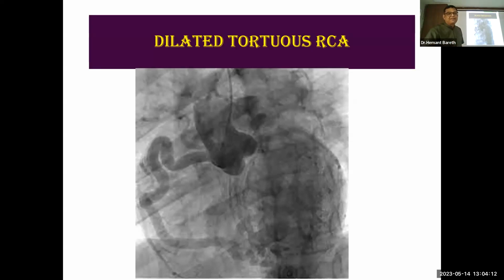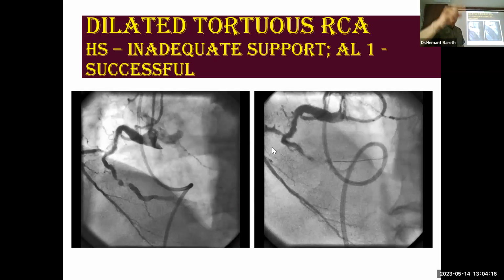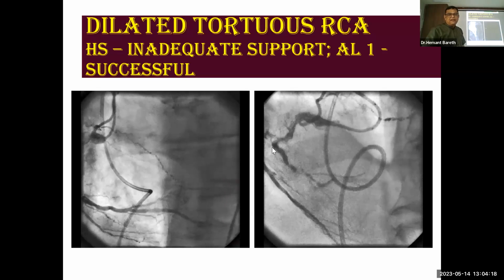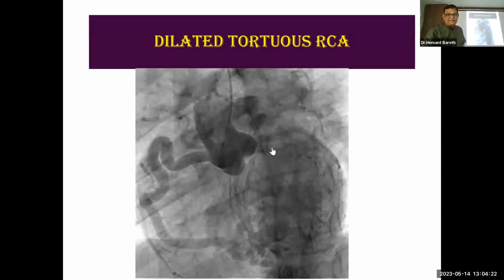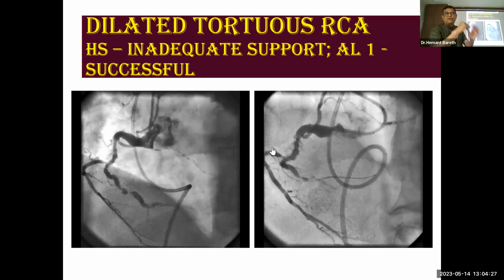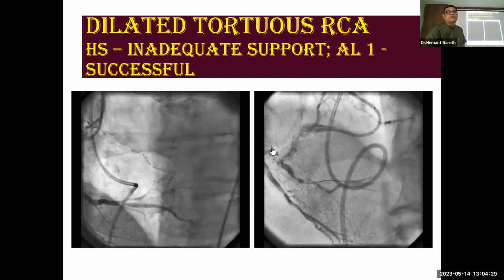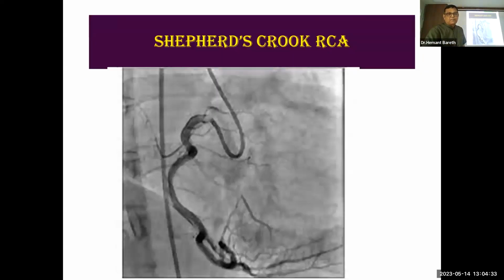Mother and child, of course. Final is mother and child. Somebody tried hockey stick, and you can see that support was, yeah, somebody saying AL. Hockey stick was tried initially because they thought it was a horizontal thing, but obviously not giving much support. So this was the problem. What about this? The ideal catheter would have been AL.